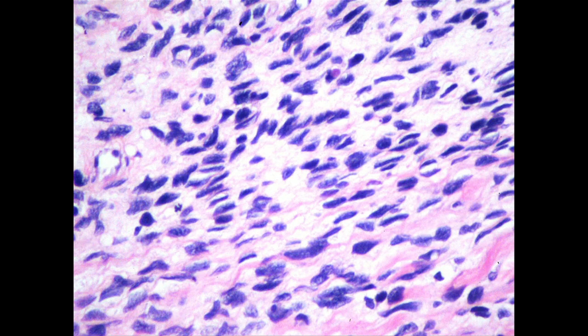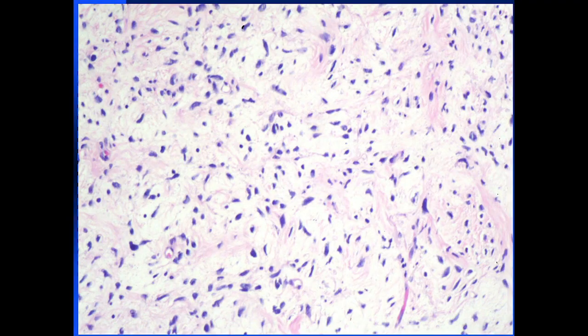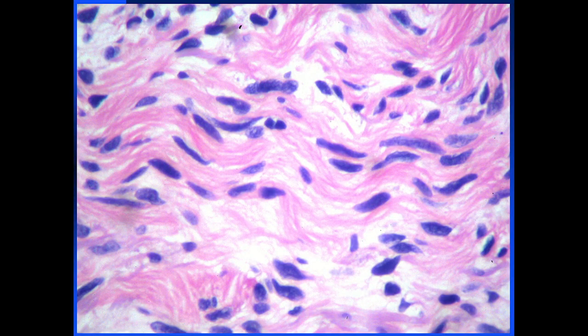Another area, this looks a little bit more malignant, but you could say that this looks like a fibrosarcoma, spindle cells in parallel. Here, they're interspersed. There's only a little bit of atypia, but they're separated by a mucinous material. This looks like a myxoma. Another area, the cells are very wavy, and the collagen is very wavy. This looks like a neurofibroma or a schwannoma.